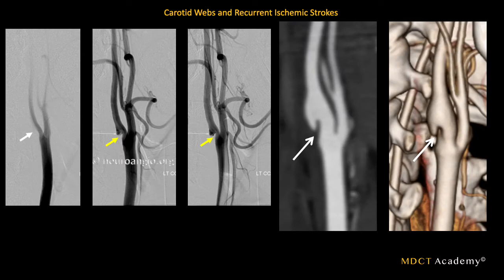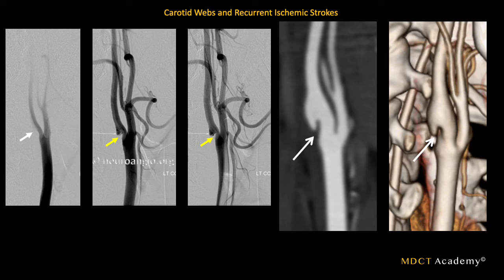Looking at this case, you can see the carotid web in a patient with recurrent ischemic strokes. The yellow arrows on the DSA and the white arrow on the sagittal MPR and 3D volume rendering might look like a dissection, but this is smooth-walled with almost one flap in the middle of space and a little bulge — characteristic of a carotid web. This fibrotic area thickens, alters blood flow, and causes blood clots to travel further up. Treatment would involve placing a carotid stent. This typically occurs at the level of the bifurcation.